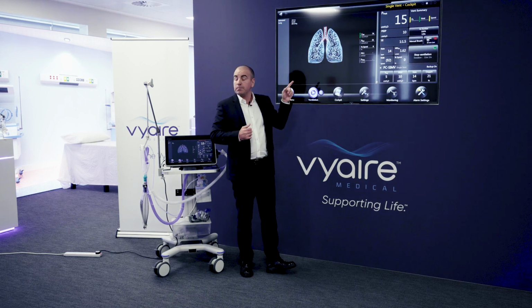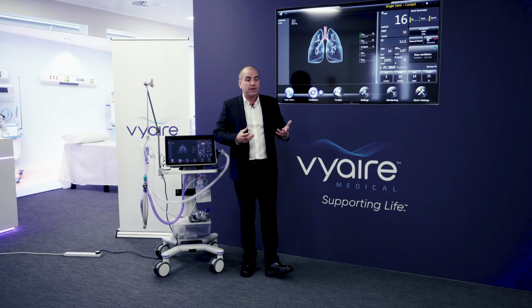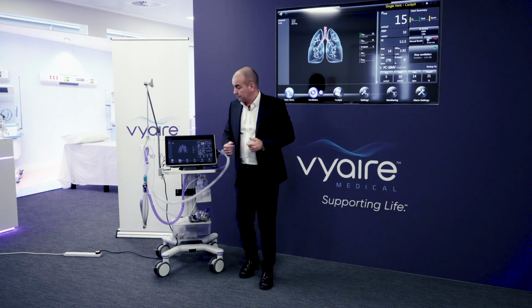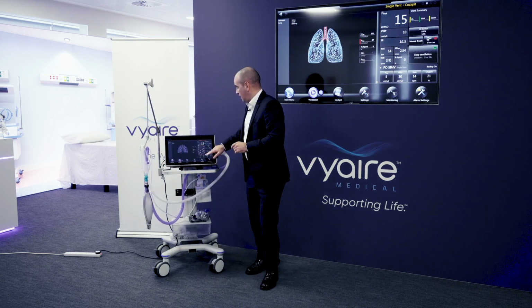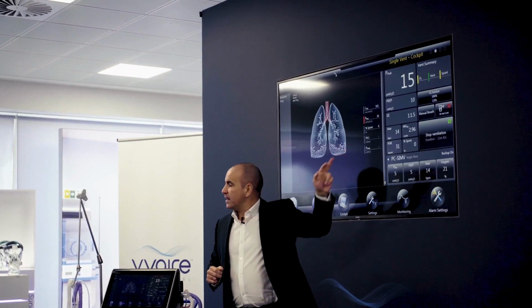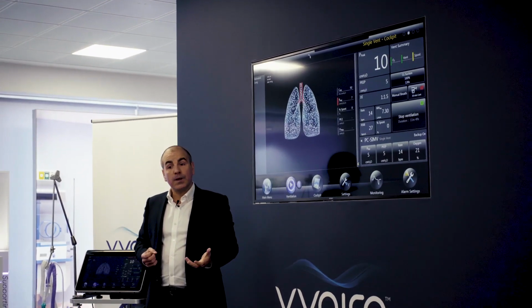So you can see that there's potential here that maybe the patient needs suctioning, maybe they need reassessing for their bronchodilators. So various reasons, but at least it gives a very quick reference to the busy clinician that maybe something just needs to be reassessed. So we'll just pop that back to normal. I'll just drop this measurement back down. Over on the top right-hand side there, again, we have another visual indicator there that provides objective metrics for the clinicians to assess their patient.